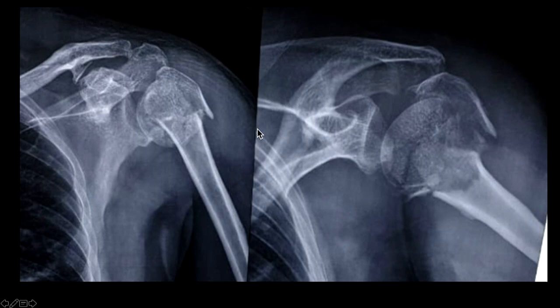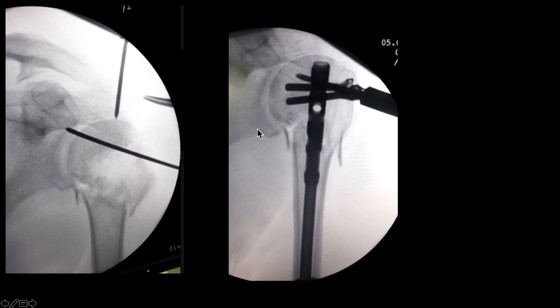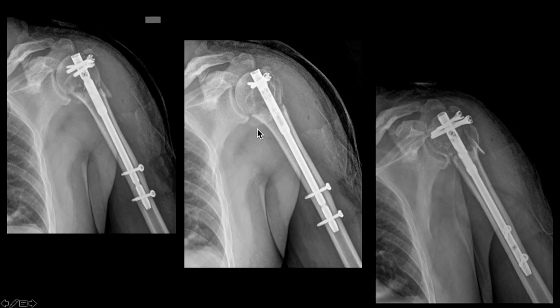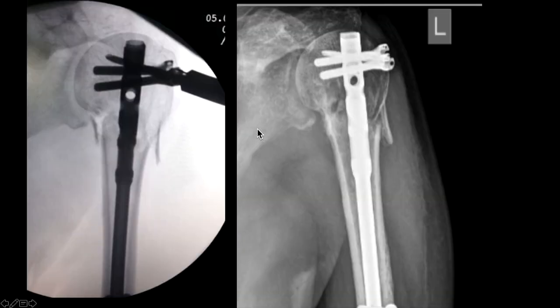That was what the patient had all these years. So we can't be thinking that the head is not there, because it's not an open fracture, there can't be a bone loss. So anatomical neck fractures are, again, much easier to do with a nail. Get the valgus reduction, get the tuberosities back, good entry, and we could do it with a nail much more easily. That's at union.